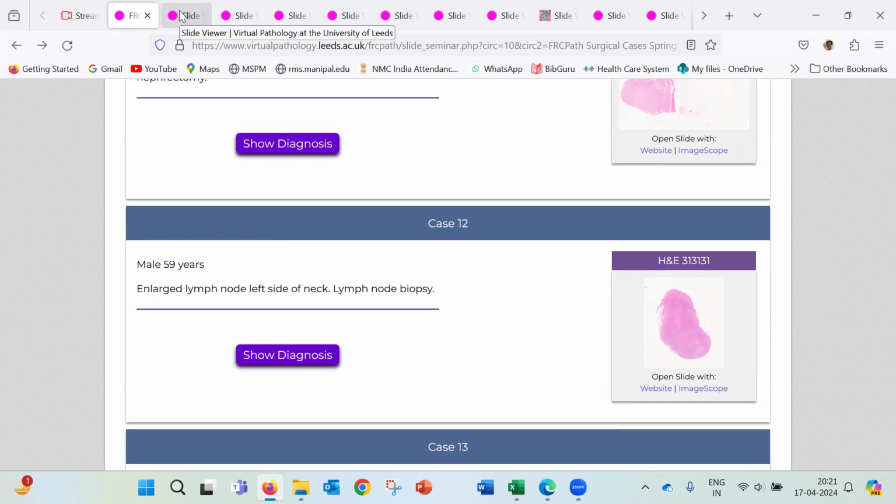Gangliocytic paraganglioma. Ganglioneuroma will have this kind of Schwannian stroma along with irregularly clustered ganglion cells. So that is very characteristic for ganglioneuroma. Gangliocytic paraganglioma is typically located near the ampulla. They are typically known to occur at that location. And they don't have this kind of Schwannian-rich stroma.